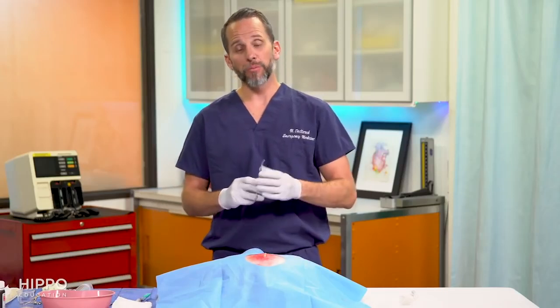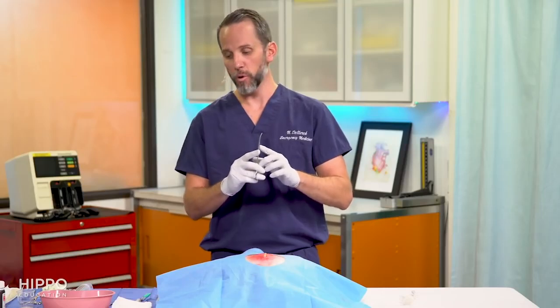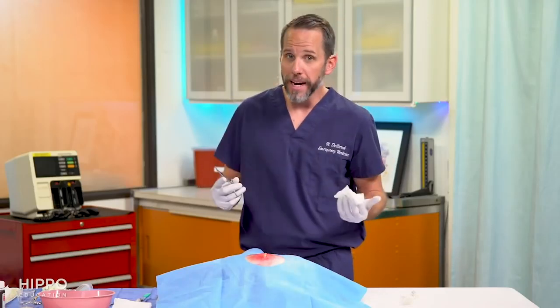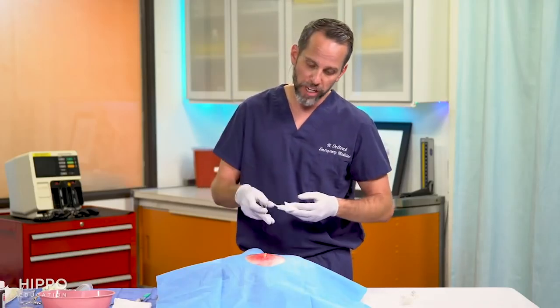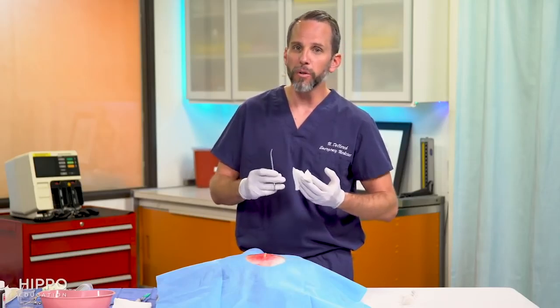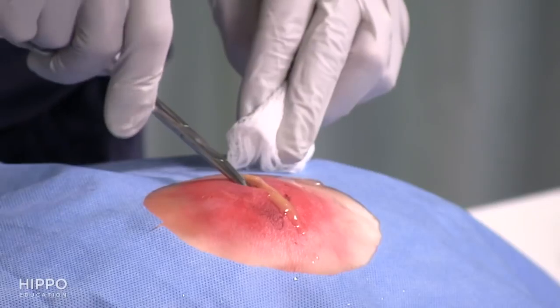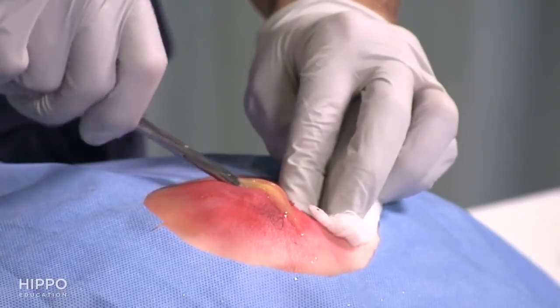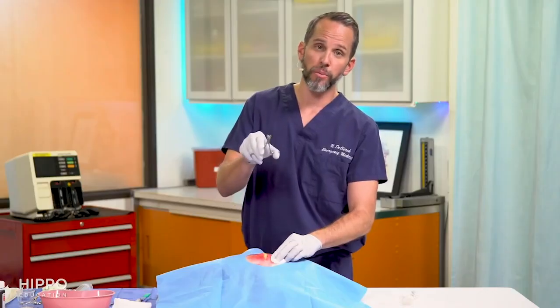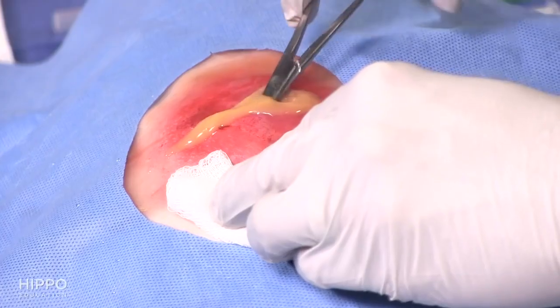The next step — and probably the most important part of the I&D — is blunt dissection. Take your blunt curved forceps and have a couple of 4x4 gauzes ready, because this is also the most painful part. Go into the abscess and bluntly dissect, opening it up and breaking up all the loculations inside, making sure to get all the pockets of pus.